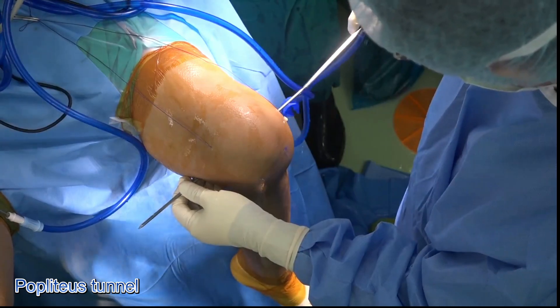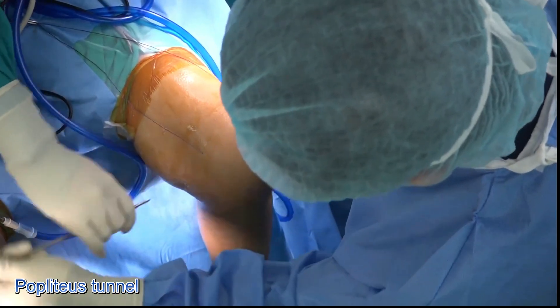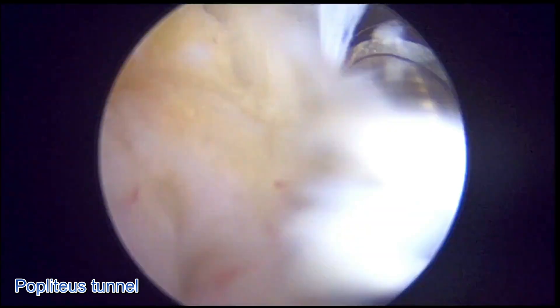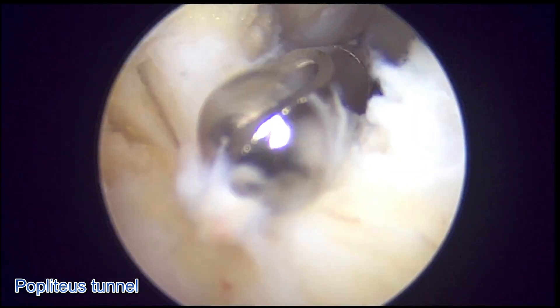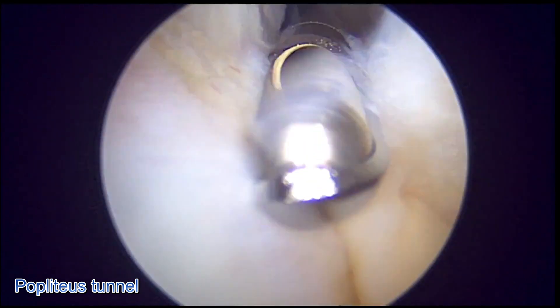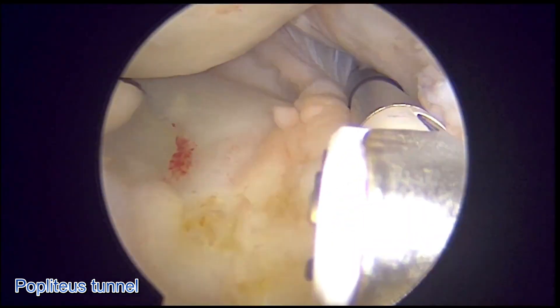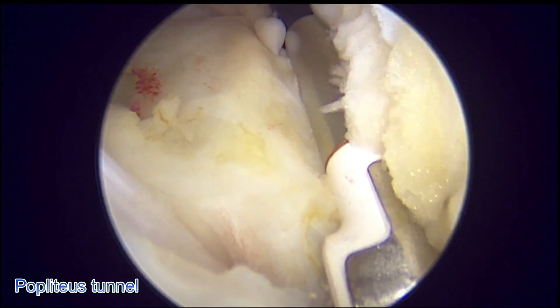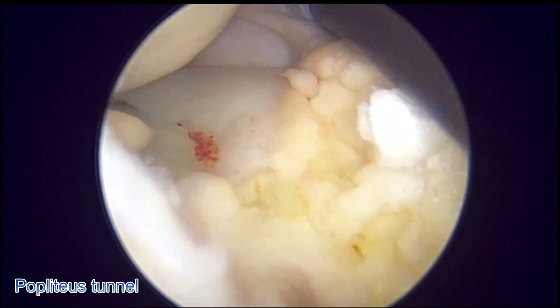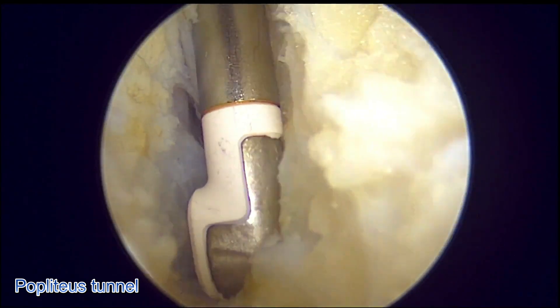We now switch our camera to the posterolateral portal. Clearing is done from superior to anterior and inferior, avoiding the posterior where the neurovascular bundle is. The tibial tunnel will be made at the musculotendinous junction of the popliteus.